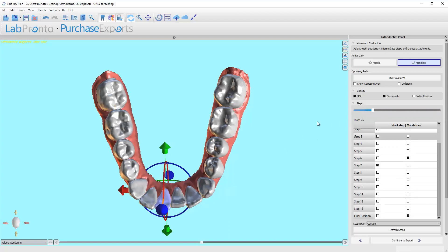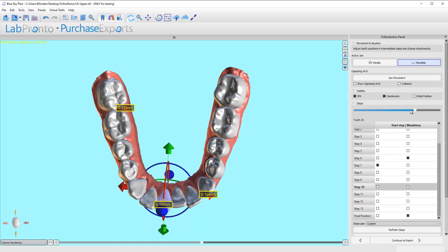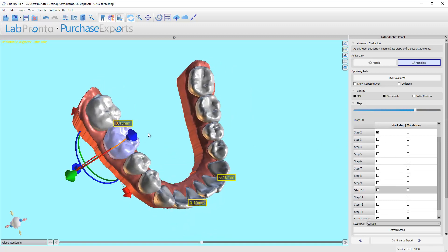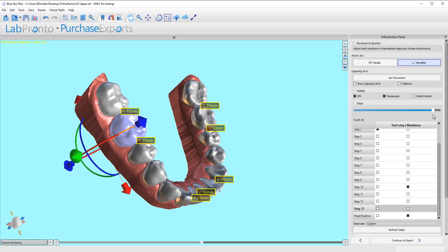Now let's take a look at the lower arch. I'm okay with 0.1, possibly even 0.15 between molars. But anything above 0.1 and I'm thinking maybe I could do things a little differently. So let's figure out how we could move this. I can just tip it forward just a little bit until it has some contact with the tooth in front of it. Hit refresh steps — and that's fine. I don't care about any of these 0.1s.